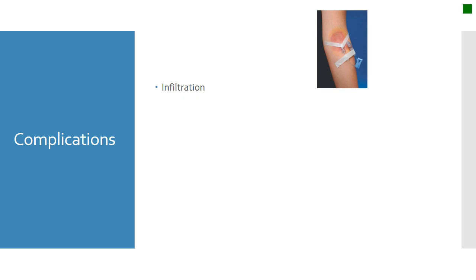The infusion may be slowed, therefore the pump will be beeping at you. You should stop the infusion and remove the IV. You may need another IV elsewhere, but be mindful if you do it near this area. If it's connecting to the same vein, you may have the same problem again in a few minutes.